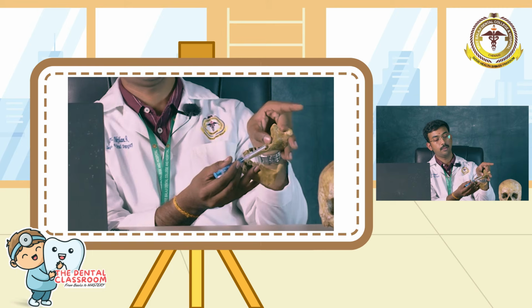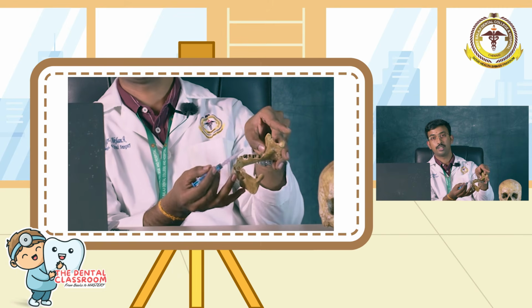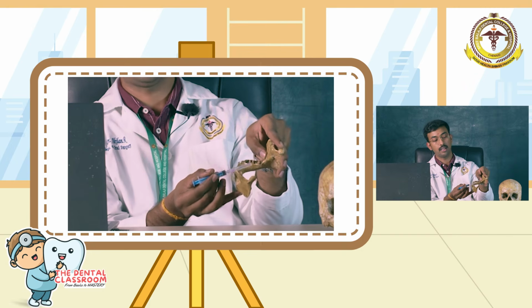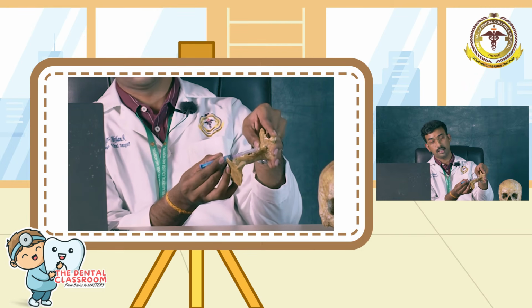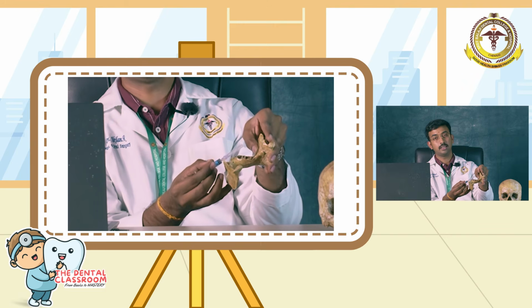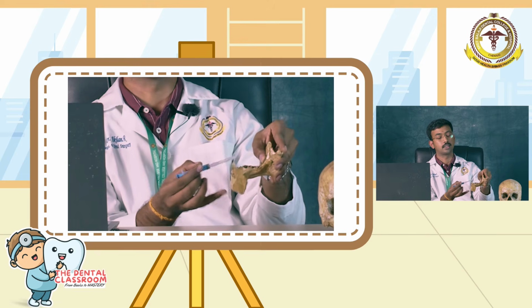So, as you can see, I am holding my left hand thumb in the coronoid notch and I am holding my syringe barrel parallel to the mandibular occlusal plane, and with the imaginary bisecting line of my thumb finger, I am starting to penetrate my needle, preferably with the bevel of the needle facing towards the bone, but it is not critical for this particular procedure.